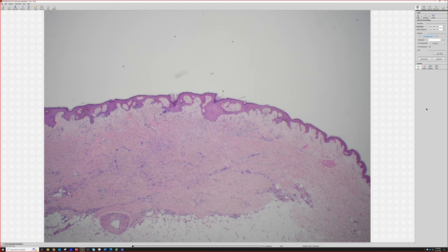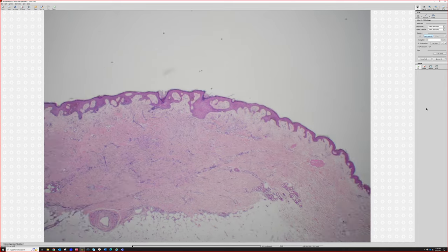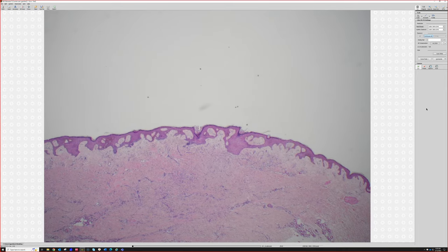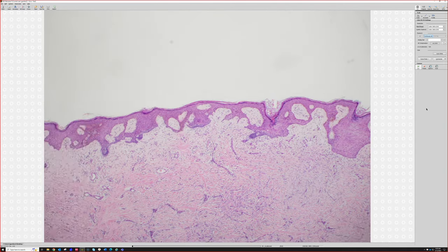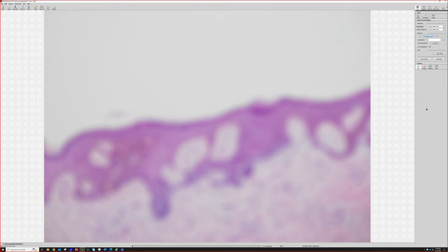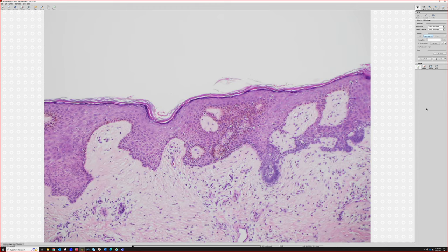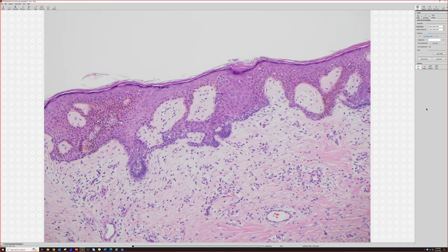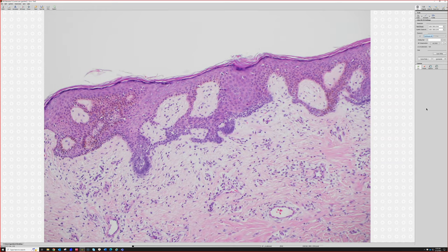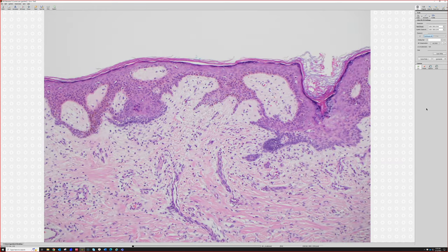This one's got a lot. Look at the normal epidermis and then the epidermis gets much longer and reedy — some of them are flattened or blunted at the bottom. More impressive than that, we have increased pigment, which is the most common thing we see: elongated reedy, flattened or blunted or tabled — whatever name you like — at the bottom, with increased melanin pigment in the keratinocytes. That's why a lot of dermatofibromas look brown clinically.